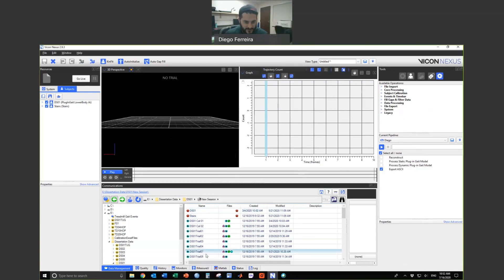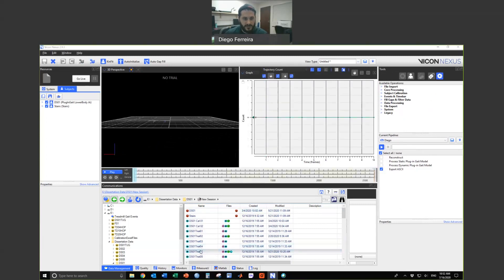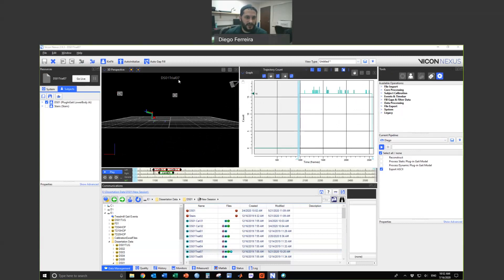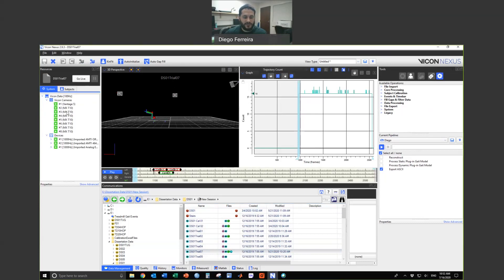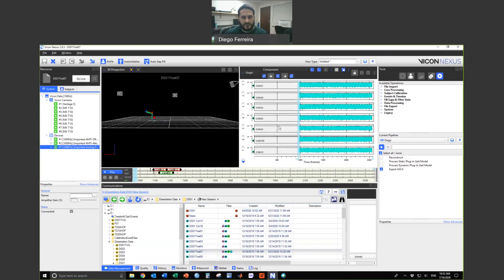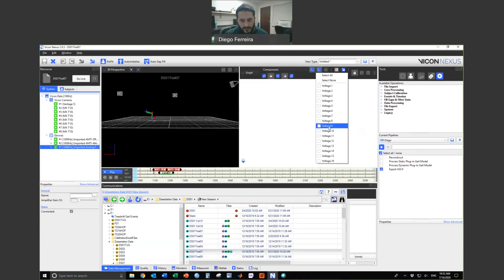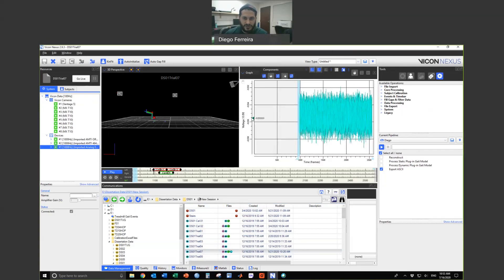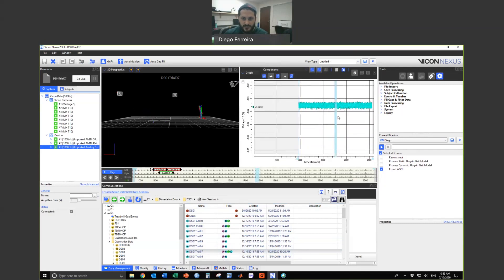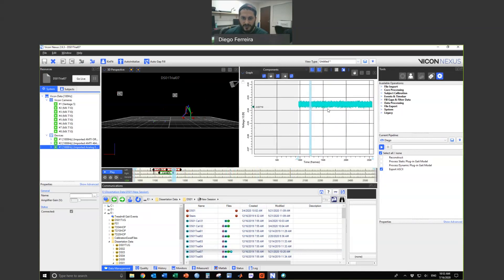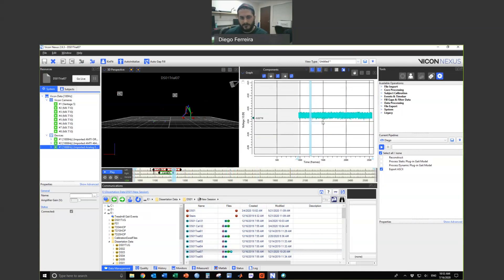I'll open a file by double clicking it — sometimes it takes a little while. You can see the filename is now shown up top, so there's an open file. If I click on System, it'll show me all the devices I used. For example, looking at the EMG — it says Imported Analog EMG — it'll pull up all of the electrodes. I can select which ones I want to view, say only electrode number 10. You can change the shape and size of the graph by right-clicking and dragging to change the scale, and left-clicking to move to a specific frame.